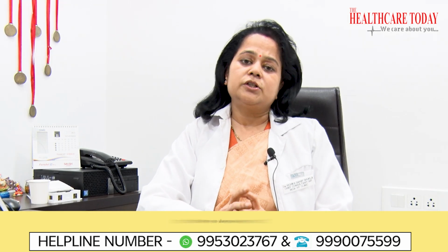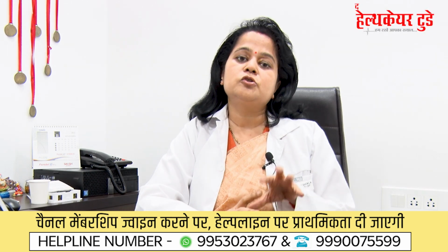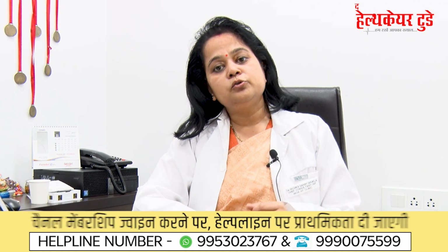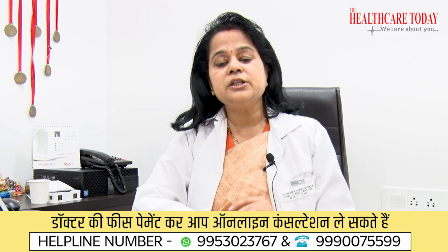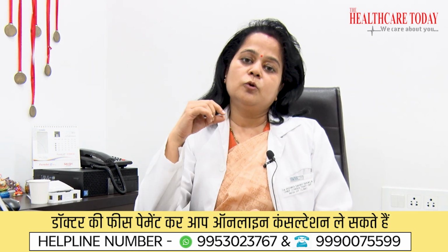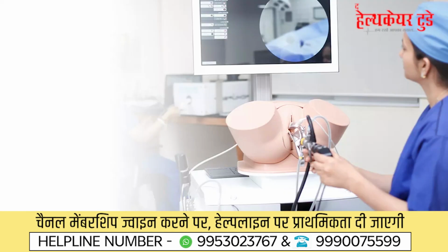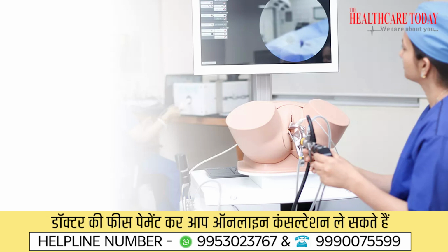So coming to what is a hysteroscope, just visualize that you have a room, and that room is the womb. And in that room, you need to see what is inside. So you put a camera in that room and you're able to see it. The hysteroscope is an elongated tube with a camera in it, and we put it inside the uterus to have a panoramic view of the uterus so that we can increase the success rate or we can comment about your uterine cavity.